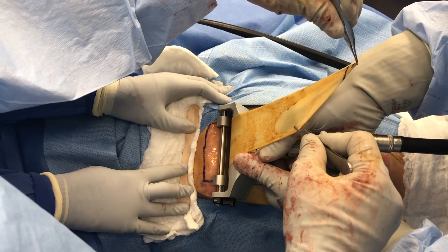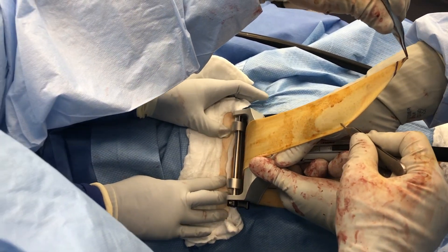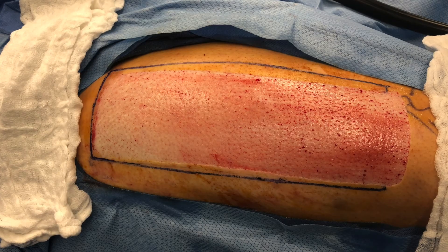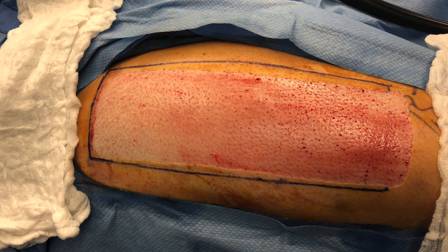As we get to the end of the donor site, we lift up at again approximately a 45 degree angle and allow this to stop. The donor site now looks like this with the top layer removed.